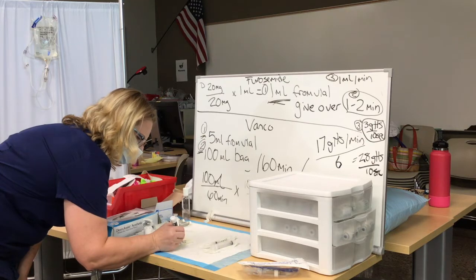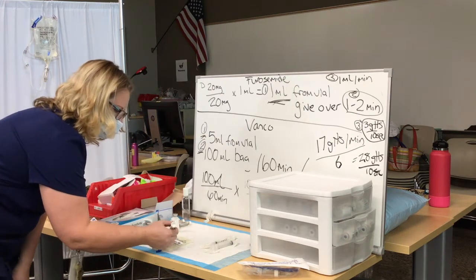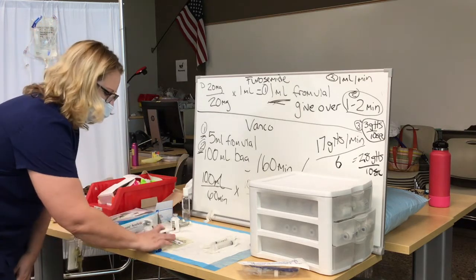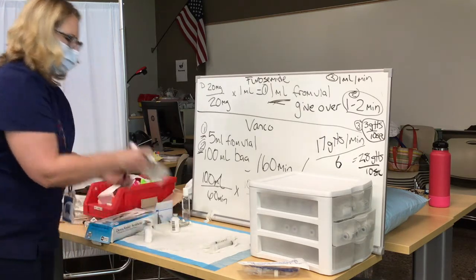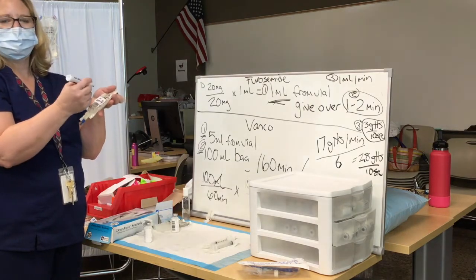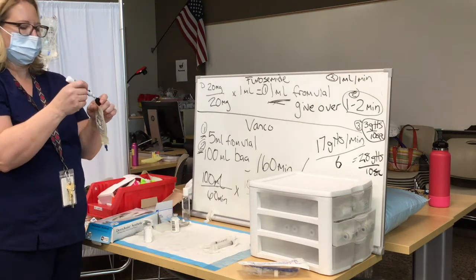500 milligrams or 0.5, whatever you're going to write, as long as you write the dose of the bag. You don't need to write in 100 milliliters. The 100 milliliters is right there on the bag. So at the very minimum, this is for Armando arm. This is vancomycin 500 milligrams. And when we mix up a bag, if we're not going to administer right away, we're going to write when we mixed this bag so that they'll know how old this bag is.